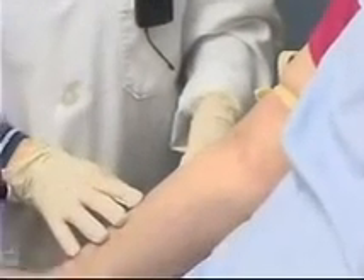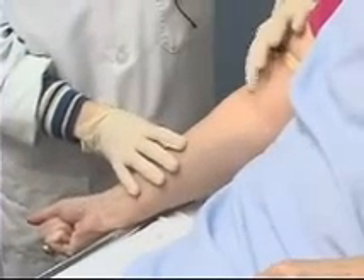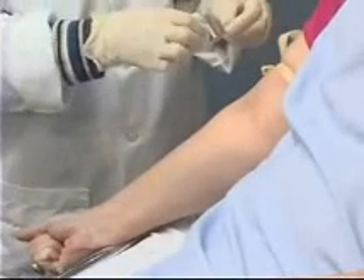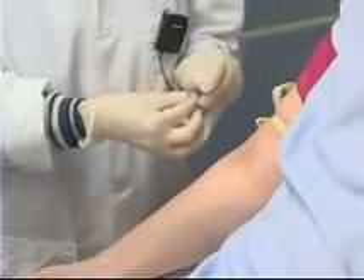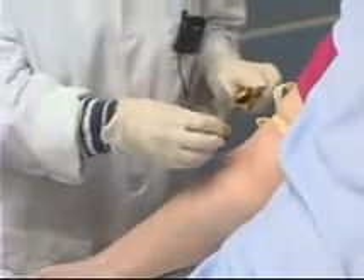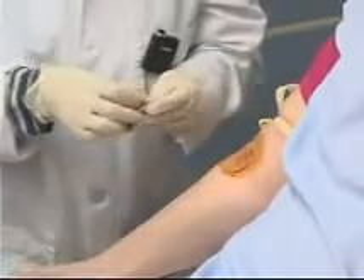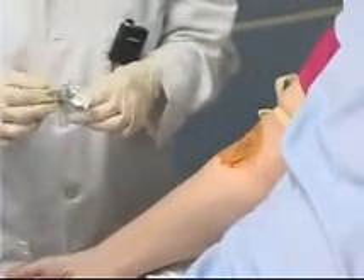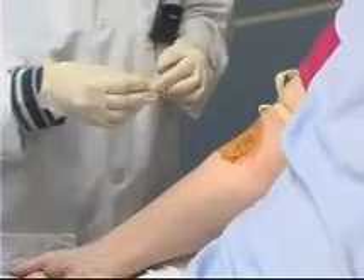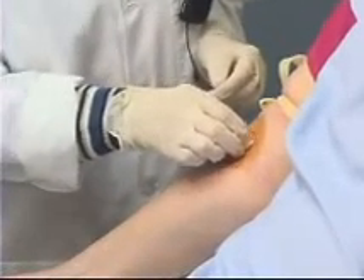I'm going to ask my patient to please make a tight fist. I'm going to feel the area — I can feel that vein. I'm going to clean the area first with some povidine solution, starting in the center and cleaning outward in a circular motion. Allowing that to dry, I can then clean the area again from the center working outward in a circular motion with an alcohol swab.